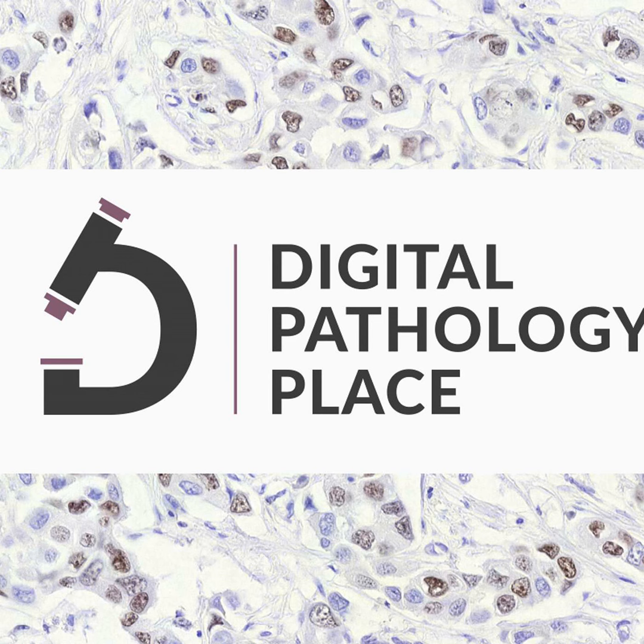Now the awareness of having to do that is a lot bigger than maybe in like 2012, 13, 14, when I was starting to work with that. Then you would basically publish data on your training set as your test set, and you would just have a super overtrained model or image analysis solution and publish that and say, oh, that's fantastic.